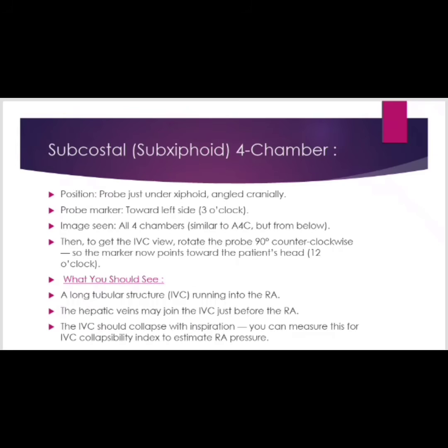Next one is the subcostal 4-chamber view. Place the probe just under the xiphoid process, which is the lowest part of the sternum. Probe marker towards the left side, which is around 3 o'clock position. In that you can see all 4 chambers, similar to A4C but from below.